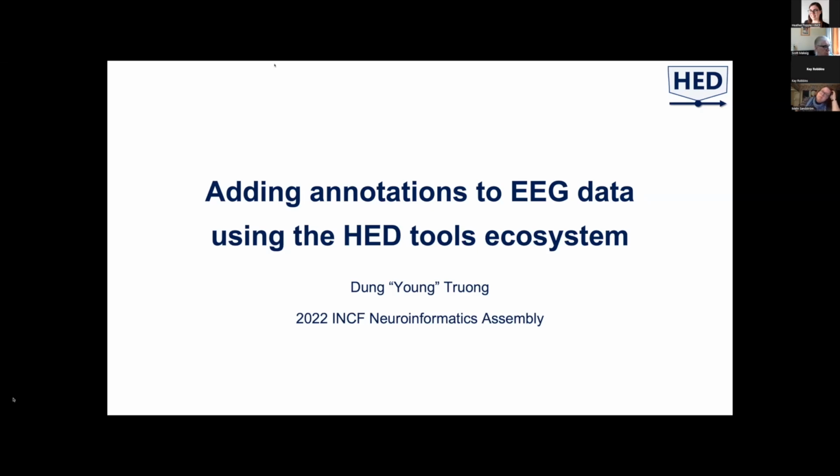As Sky has introduced, I'm Dung Truong, I'm a graduate student at UCSD. And so I'll be going over the tools ecosystem that we built around HED to aid with the annotation process, and more specifically for EEG data.